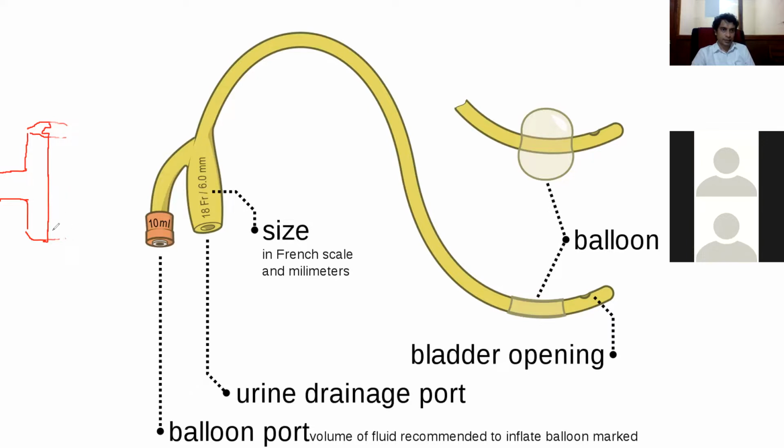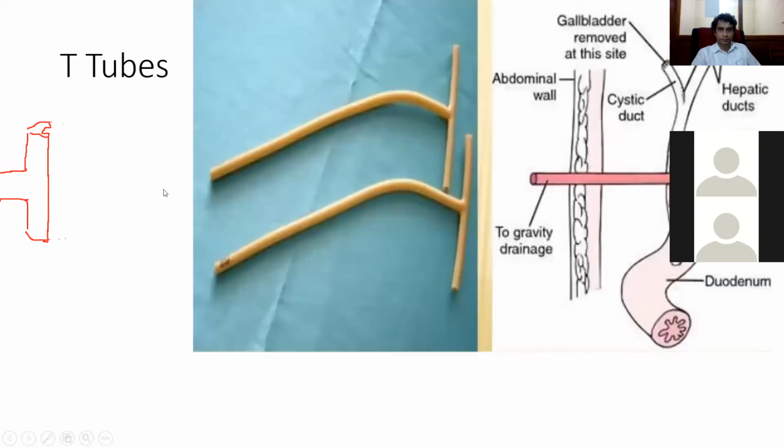Yeah, we can cut the tube like that, and then we have only a gutter. That gutter is enough for us, right? To do the job. Okay, that gutter is enough for us to do the job, and then when you pull the tube, it will just turn into a Y shape, right? Like that. It will just turn into a Y shape like that, and it will come out.